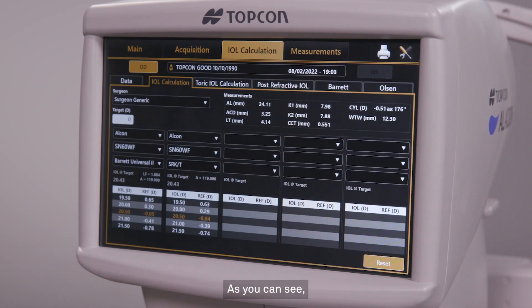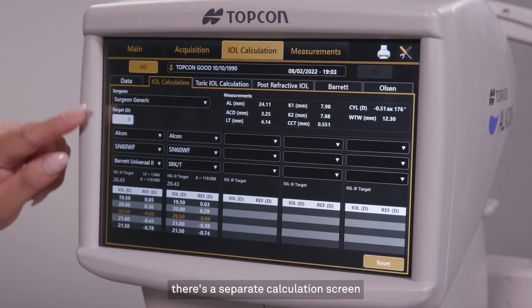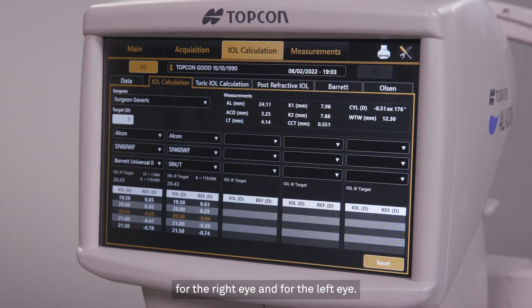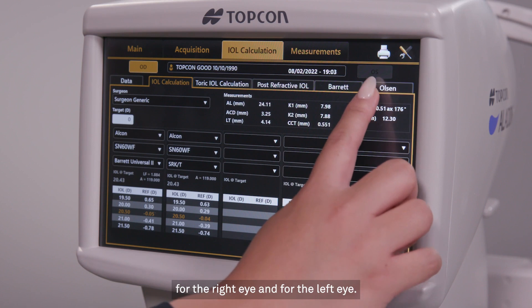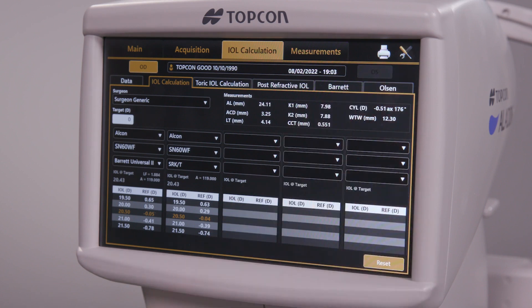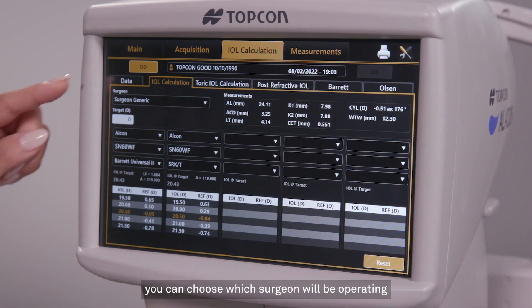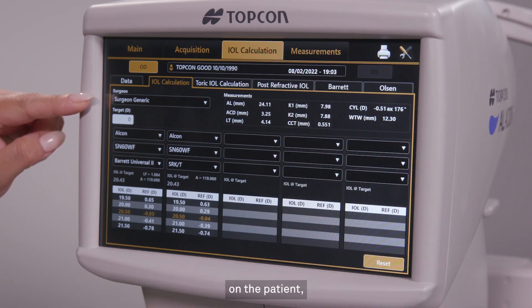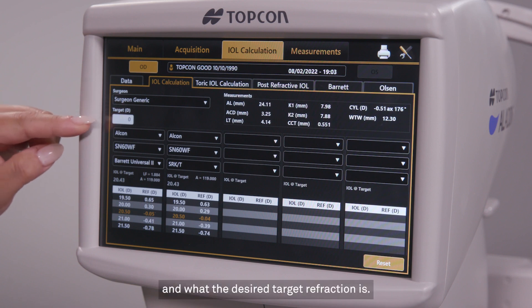As you can see, there's a separate calculation screen for the right eye and for the left eye. On this screen, you can choose which surgeon will be operating on the patient and what the desired target refraction is.